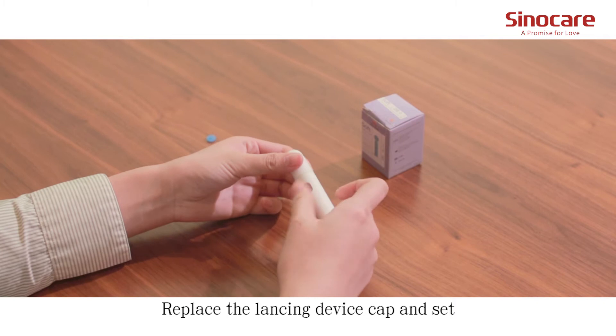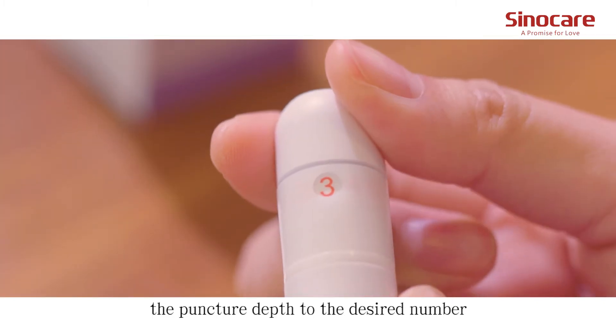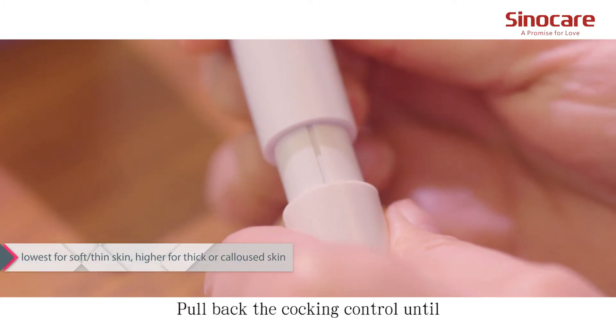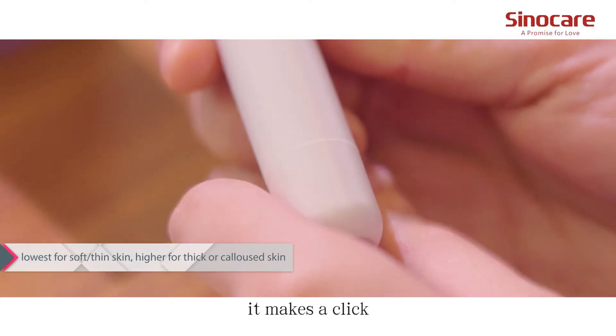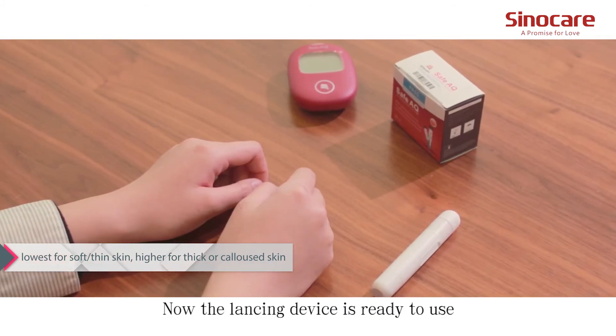Replace the lancing device cap and set the puncture depth to the desired number. Pull back the cocking control until it makes a click and then release. Now the lancing device is ready to use.